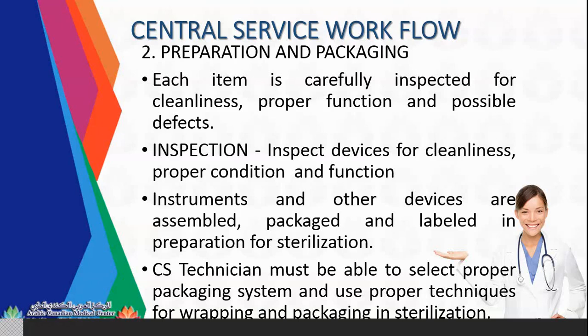Instruments and other devices are assembled in this area for testing, and then assembled again once you are finished testing. Then they are packaged and labeled in preparation for sterilization. The CS technician must be able to select the proper packaging system and use proper technique for wrapping, packaging, and sterilization.